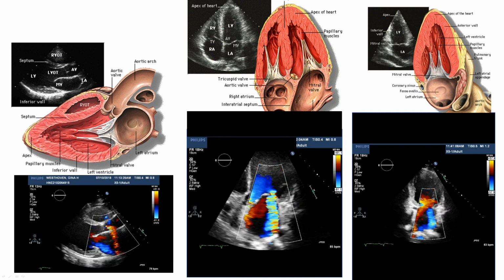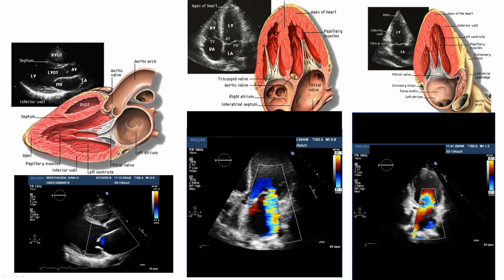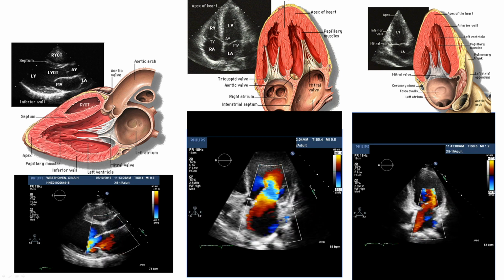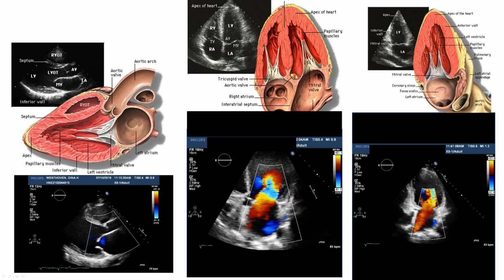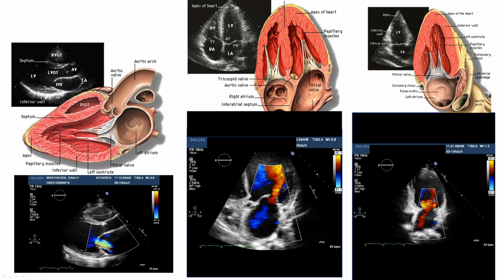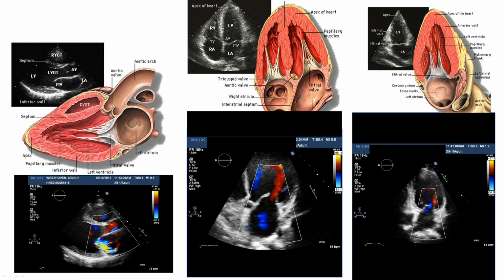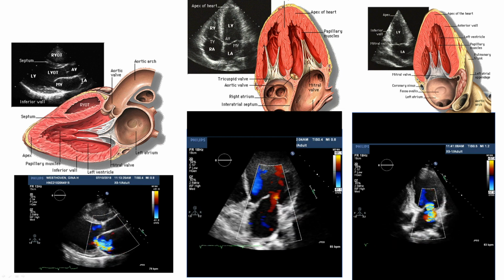For those of you that don't get to look at echoes every day like I do, I put the pictures of what we're looking at here. The first picture is what we call a parasternal long axis, so you're looking at the profile of the heart, and all that blue stuff coming backwards is blood squirting backwards through the mitral valve. The middle is the four-chamber view, and you can see she's got torrential mitral regurg there. And the two-chamber view really shows you flow pouring backwards from the ventricle into the left atrium, and that's really what the problem was. Her MR was just getting so bad that it wasn't her diet. She was doing everything she was supposed to be doing, but her MR was just so bad.